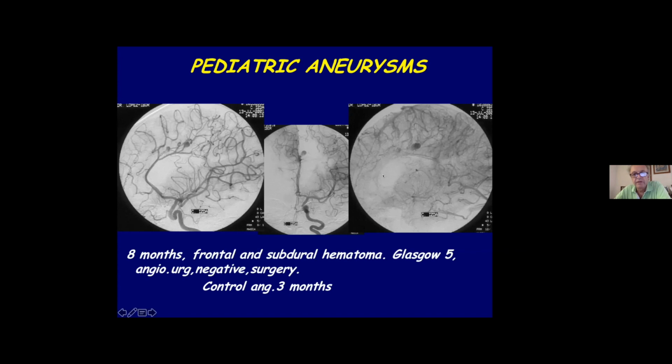And the problem to treat this is, if you navigate here, the A2 in the left side, the anterior segment A2, is too small because I have a lobectomy.